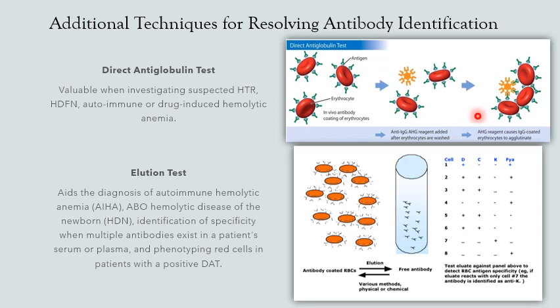Absence of agglutination needs to be added with Coombs check cells to validate the negative result. Presence of agglutination indicates presence of in vivo sensitized RBCs. So positive DAT will proceed to the next step, which is elution.